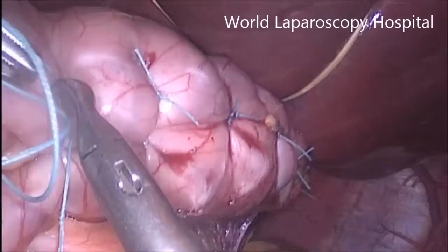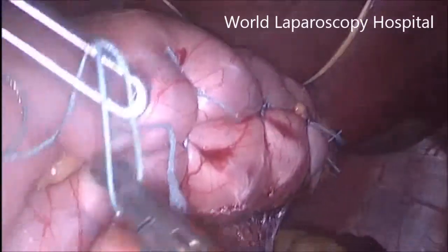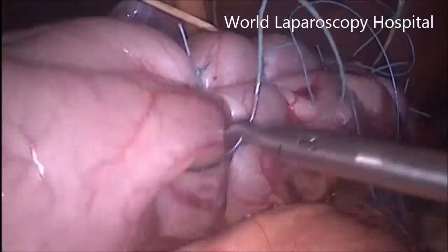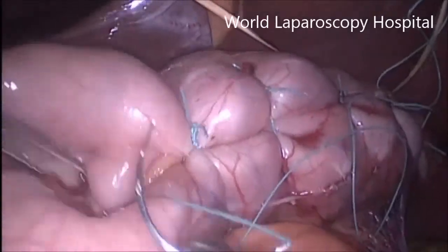So again, this is another suturing. Most of the people don't like this procedure because the long time of suturing is tiring for surgeons. Firing the staple is very easy. Suturing is a little difficult. That's why people don't want it.